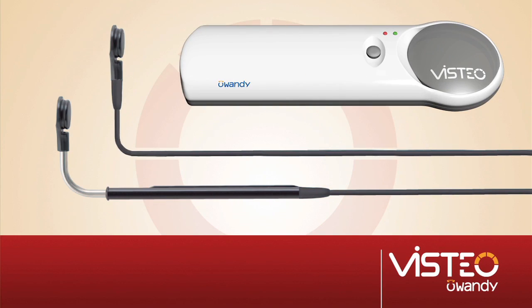Vistio sensors come with two connection cables. No other company provides you with a backup cable, nor the ease with which cables may be replaced if needed.